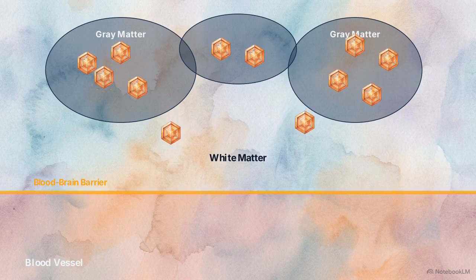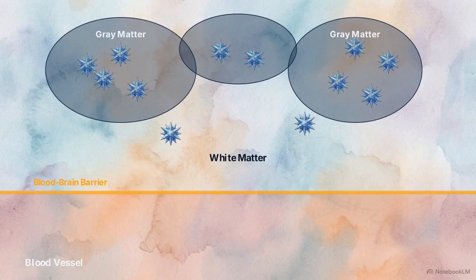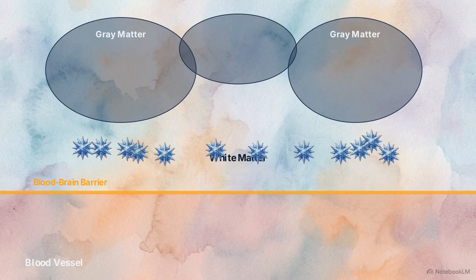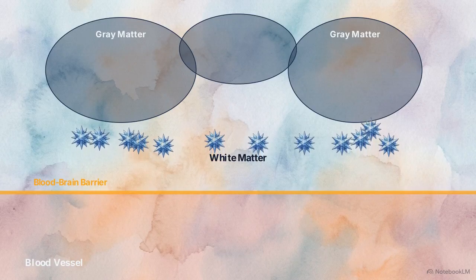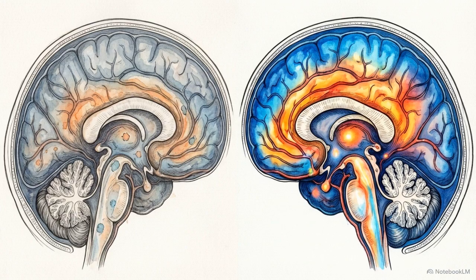But crossing the barrier is only half the equation. The tracer must stay there. Once inside the brain parenchyma, these unstable lipophilic forms biochemically convert into a hydrophilic state. This chemical shift permanently traps the agents within the tissue. Though they share this mechanism, their specific behaviors differ. HMPAO washes out of the tissue relatively fast. ECD washes out much slower, exhibits better background clearance, and does not demonstrate intracerebral redistribution over time, making it the preferred agent for stroke imaging.